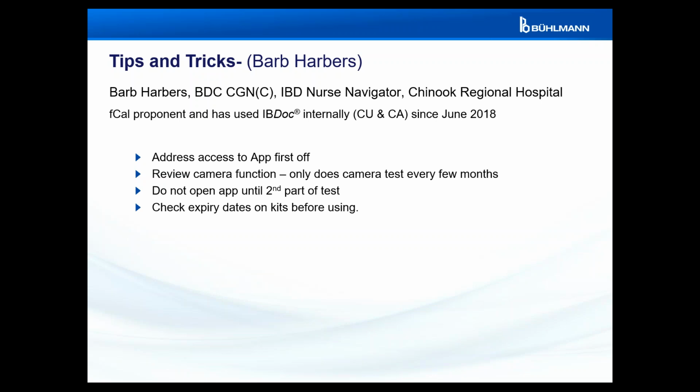And at this point, I didn't realize that the testing of the camera function only occurs every few months. It's preset that way, so that if the patient had tested the camera the day before using a kit and then had to reuse another kit the next day, it won't ask to test the camera. So the poor patient was beside himself, thinking he'd done something wrong and it was broken, and what had I done? So I now tell patients that as well when I'm doing the first introduction to the program, that the camera test function only occurs every few months, which is really how often we're supposed to be doing the IBDoc. But in some cases, if there's a fail and they repeat it the next day, that test isn't going to come up. So it's just a clarification for them.